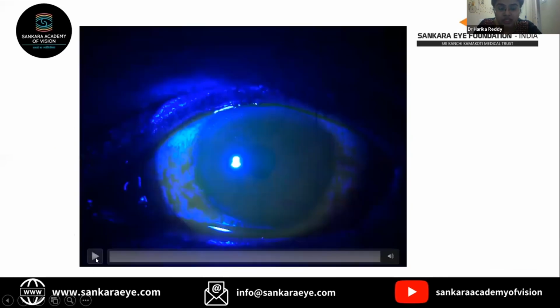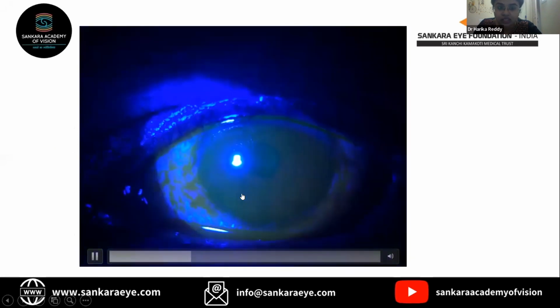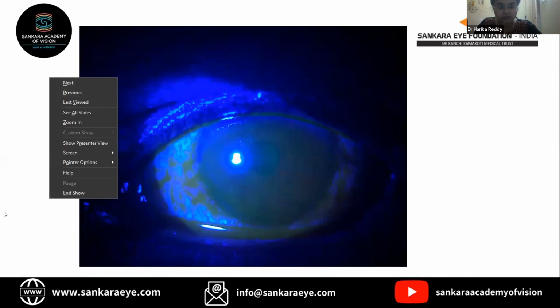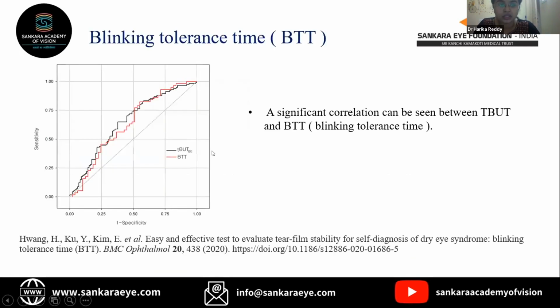This is a small video which I have recorded with the slit lamp recorder, where I have stained the cornea, and in the cobalt blue filter, here we can see a dry spot appearing. And the ocular protection index is a ratio between tear breakup time and the interblink interval. Less than 1 indicates that there is more chance of dry eye.